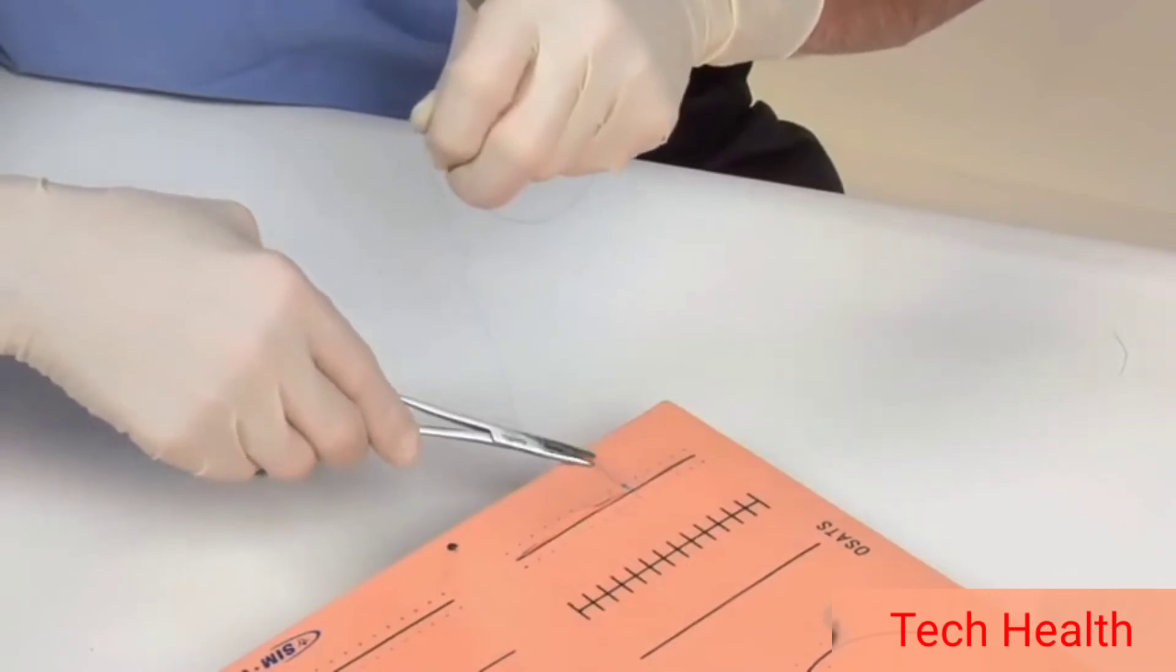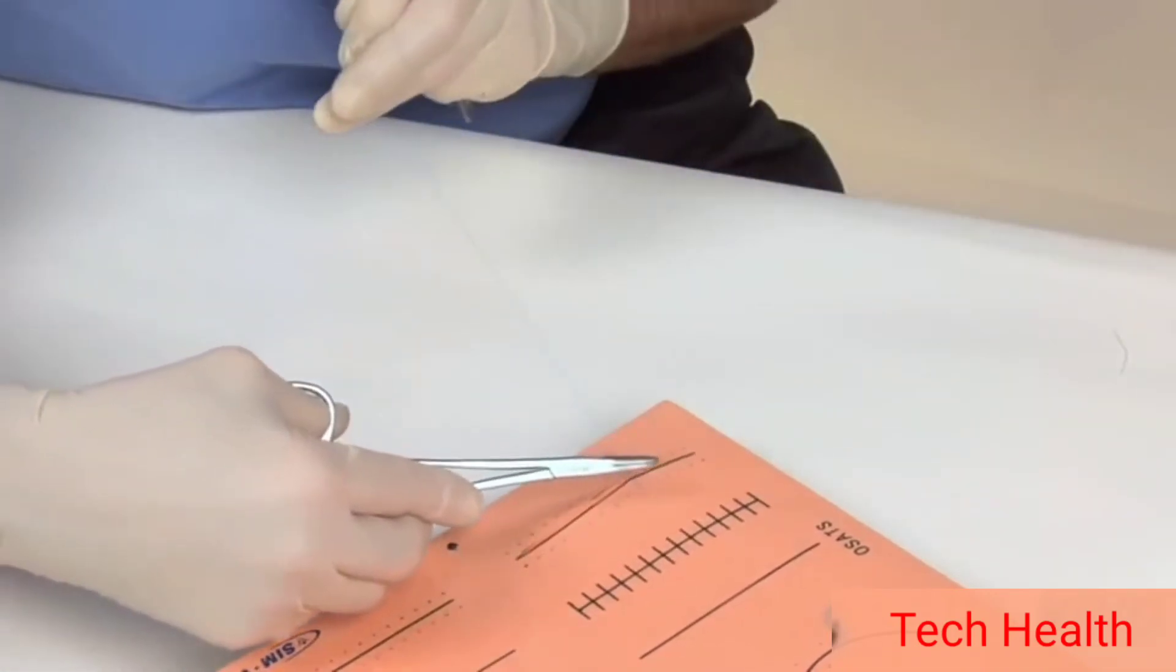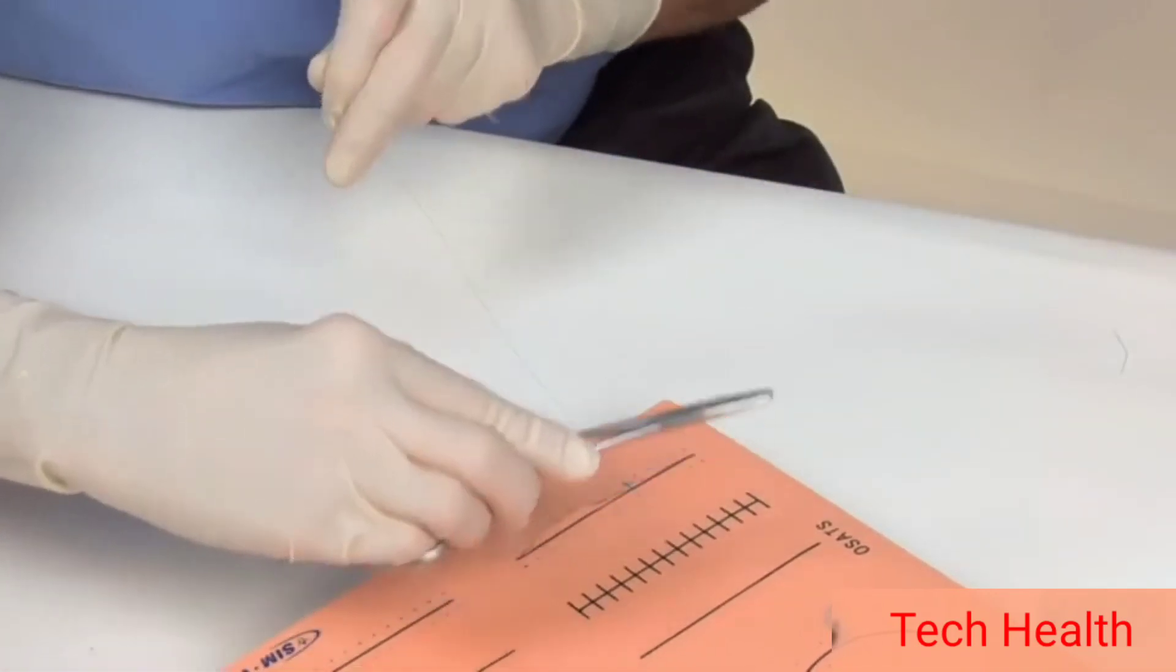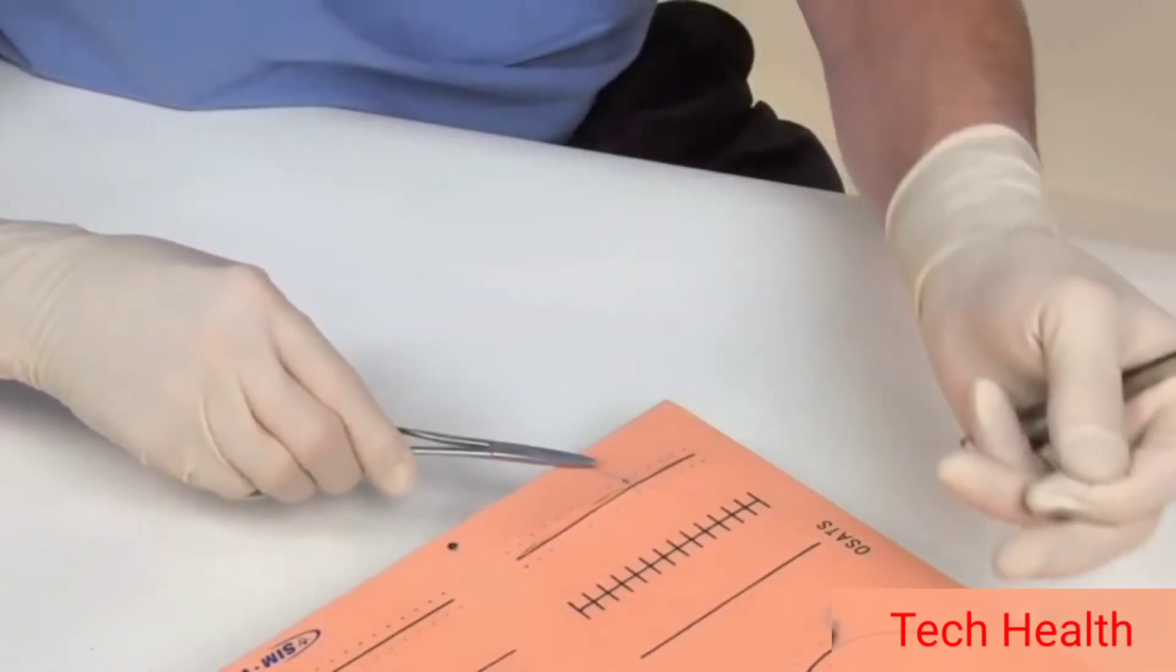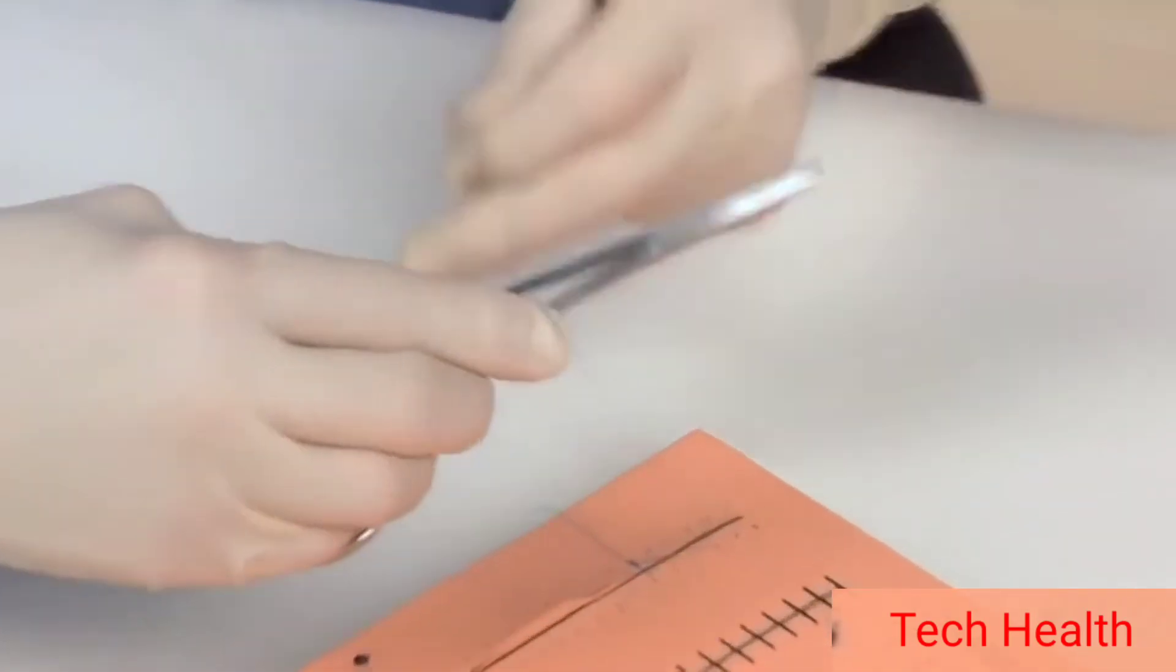Start towards you. Move away from you into the long suture. Start away from you. Start towards you. And after six throws, you will have completed the knot.